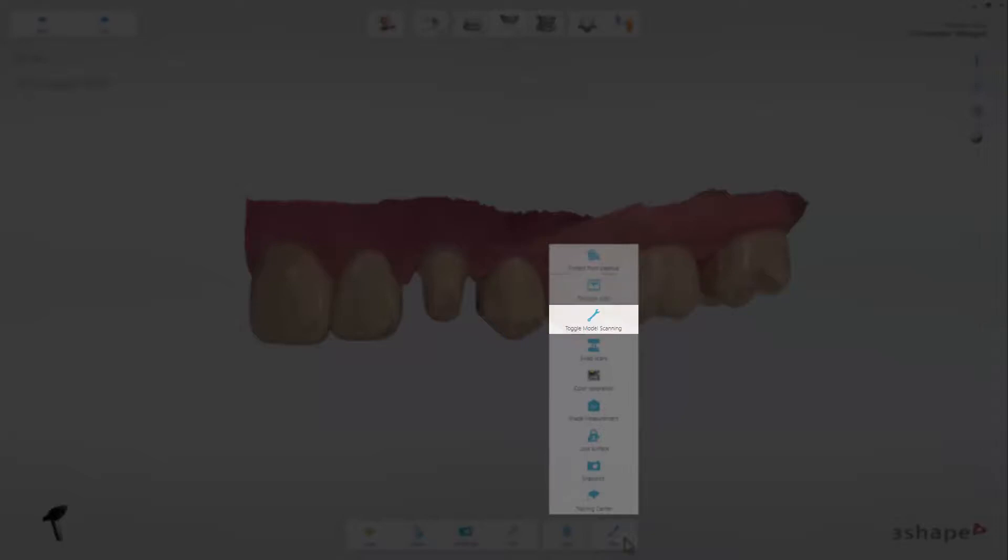Toggle Model Scanning sets the scanner to more easily obtain a gypsum model. Swap Scans lets you swap the lower to the upper in case you have scanned the wrong jaw at the wrong workflow step.